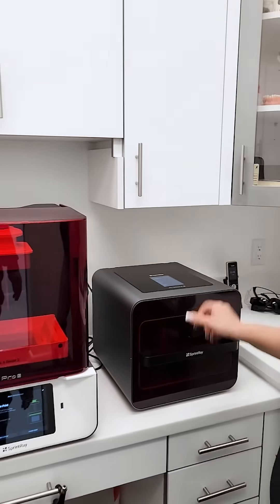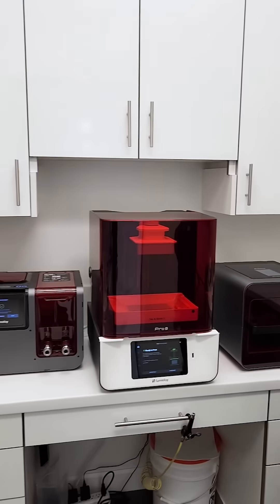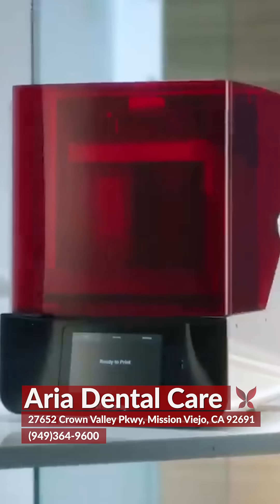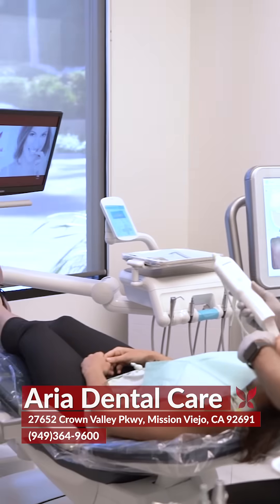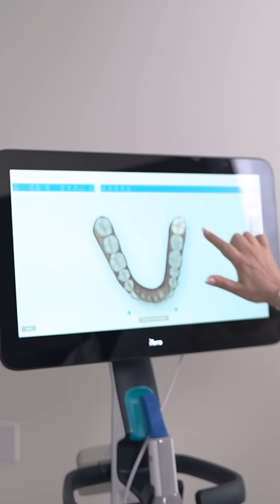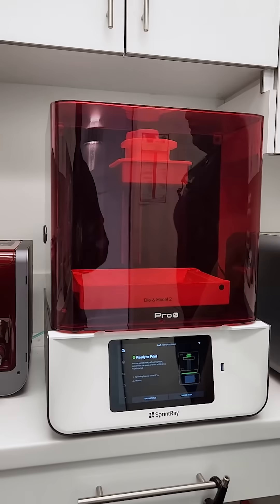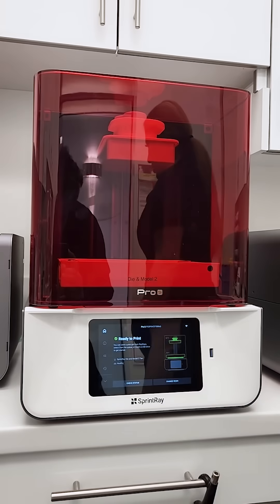This is a curing machine that makes the material set, and that's how it works. This is new technology, so patients don't even have to worry about gooey stuff in their mouth. We scan with iTero and send it here to print, and there's no delay because we don't have to send it to a lab — we just do it in our office.